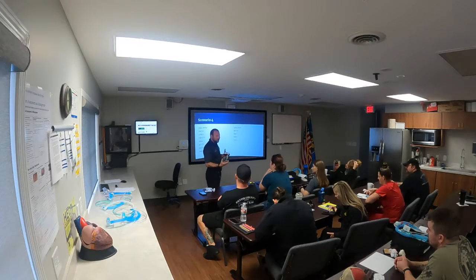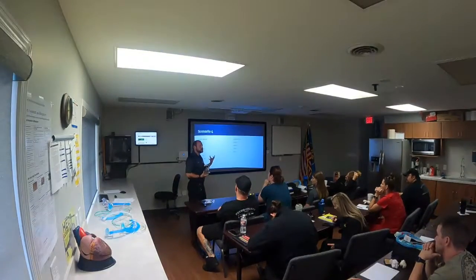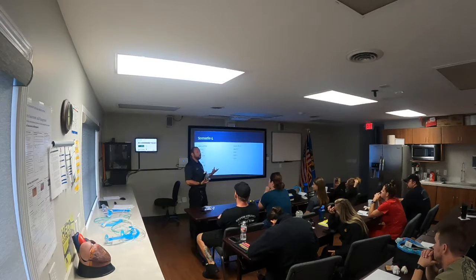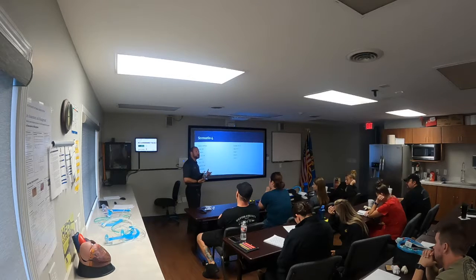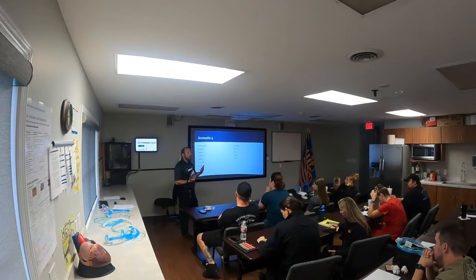Big thing that I talked about in the slides that we haven't talked about yet is leak compliance. For BiPAP or CPAP, we have the ability with the vents to do leak compliance, in that the vent will recognize there's a mask leak and compensate, so it's not constantly throwing volume at somebody thinking, oh, they're still trying to take a breath in.